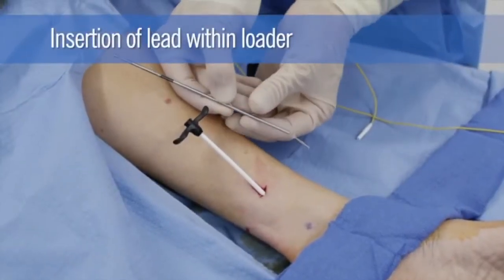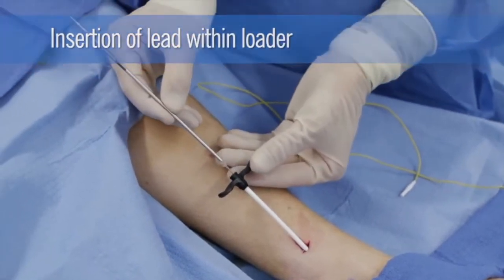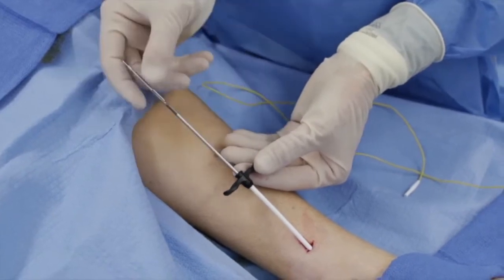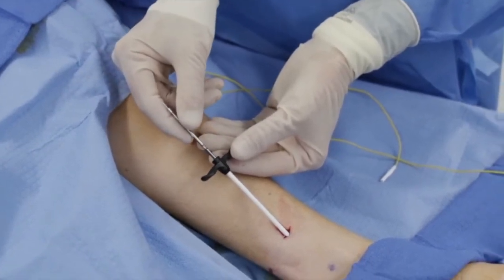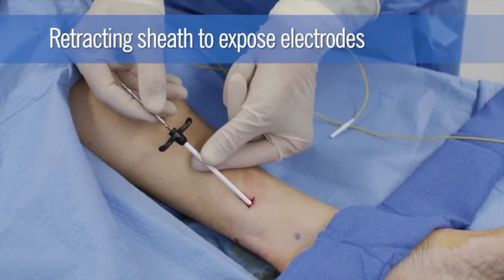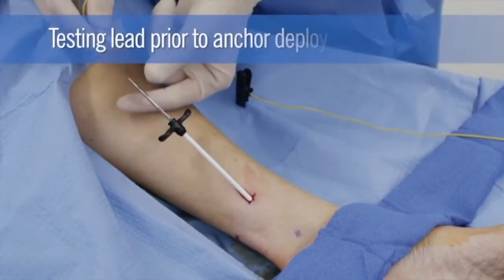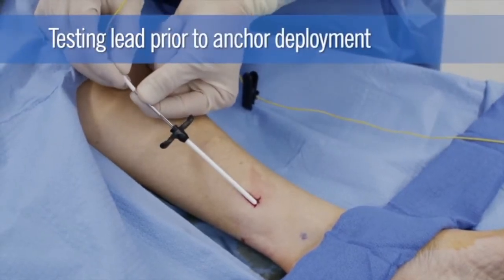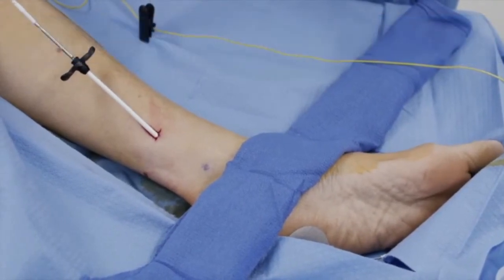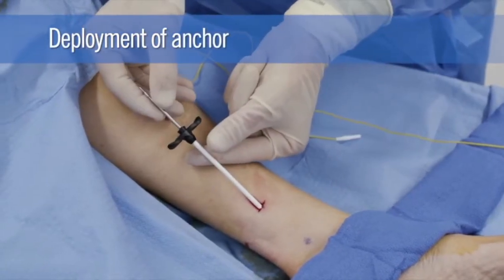The lead within the loader is then inserted through the introducer sheath until it is at the tip of the introducer sheath. The sheath is retracted slightly to expose the electrodes of the lead. Neurosensory testing is performed with electrodes exposed. Once neurosensory response is confirmed, the anchor on the lead is then deployed to fix the lead in place.